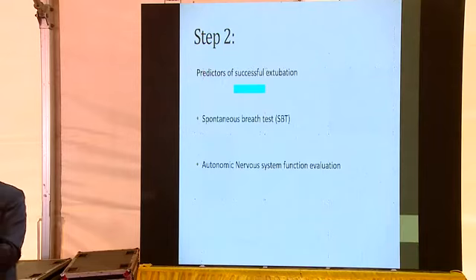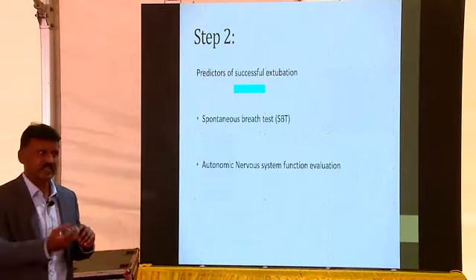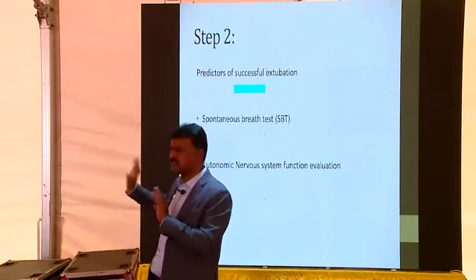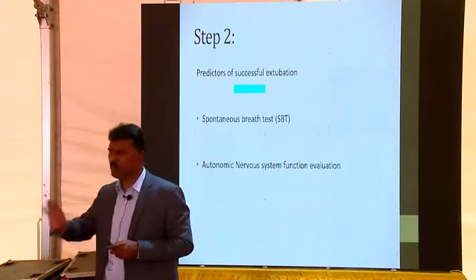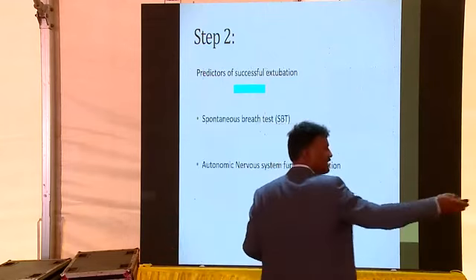It boils down to a simple message. It is still all in a sort of experimental stage. None of them are very reliable, and they need very sophisticated technology, ventilators to measure all of that. So what you can do is use clinical acumen plus your spontaneous breath test. Next slide.